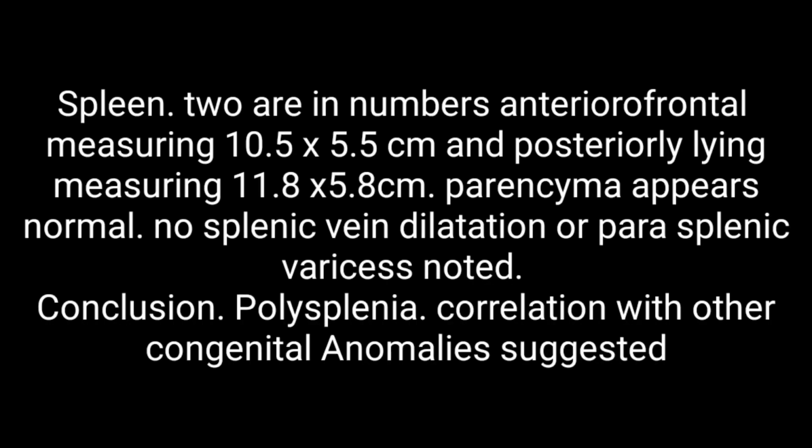Whenever there is polysplenia, mind you, there may be certain other congenital abnormalities as well, or it may be associated with other congenital abnormalities. For that, you have to have a CT abdomen for the complete survey. So this was the report for the polysplenia.